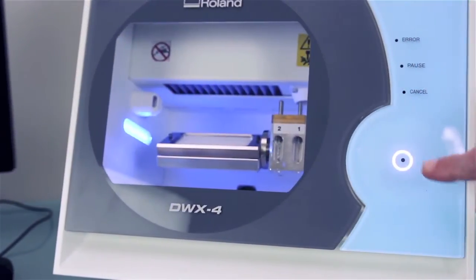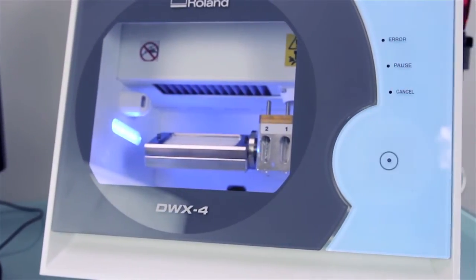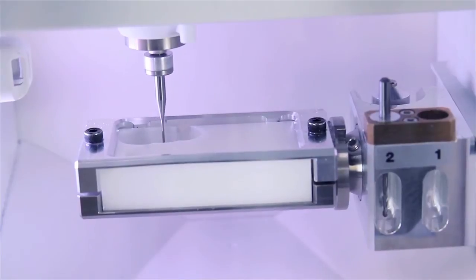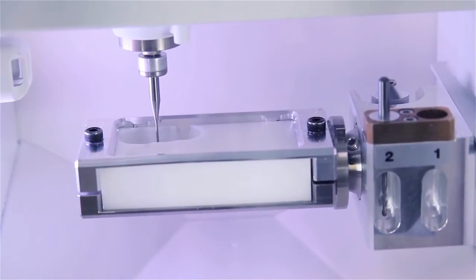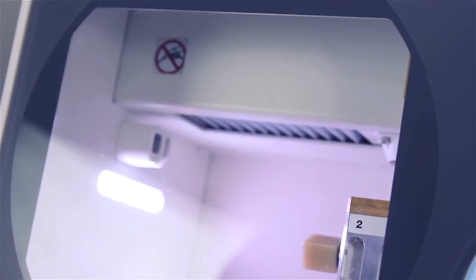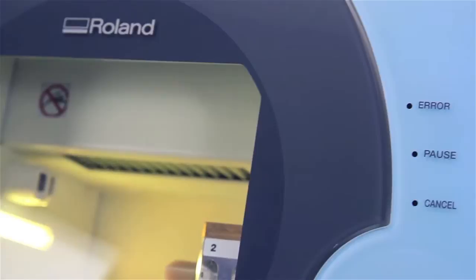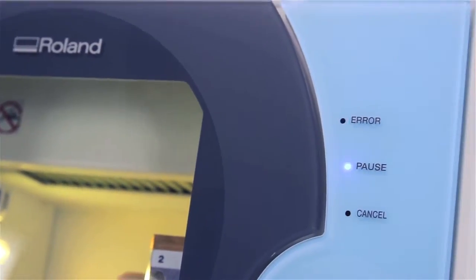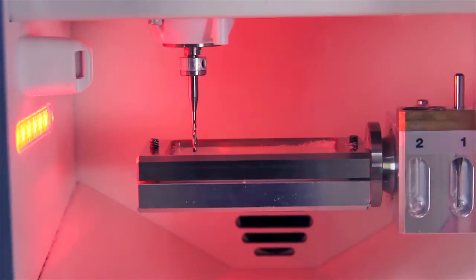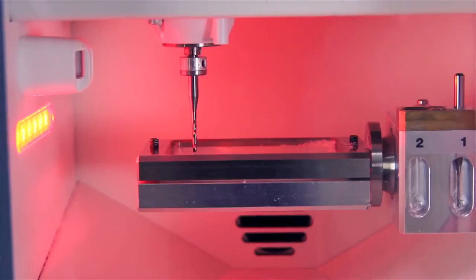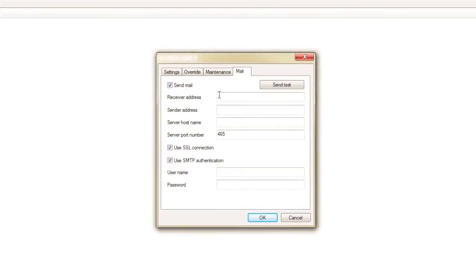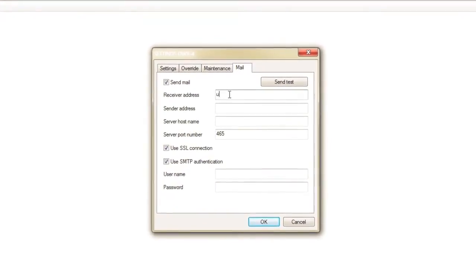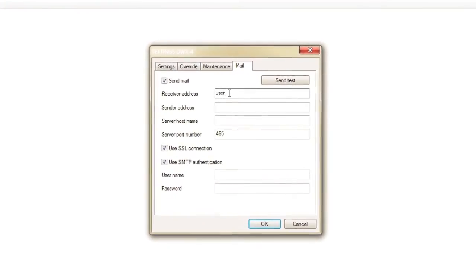A large viewing area and LED light let you monitor production. A status light alerts you of any errors or malfunctions to help prevent wasted time and materials and allow you to carry out the milling process with confidence.